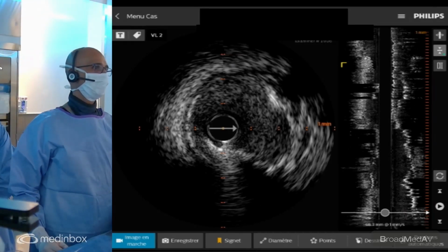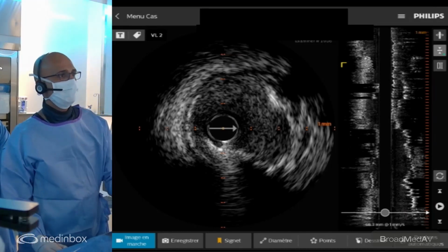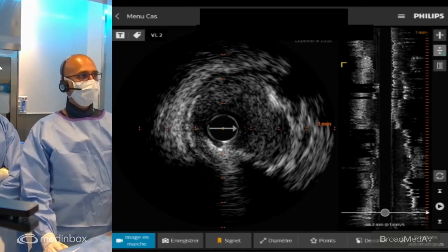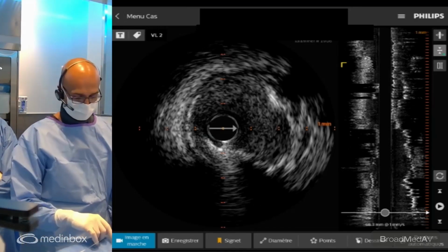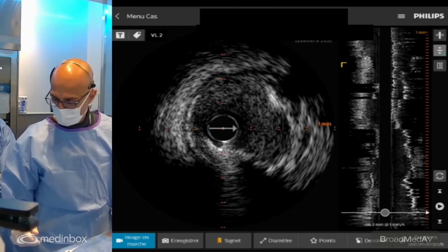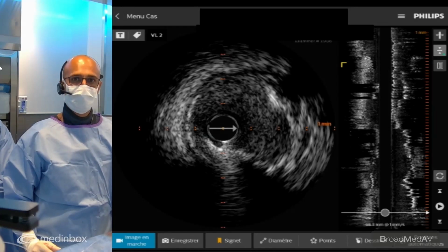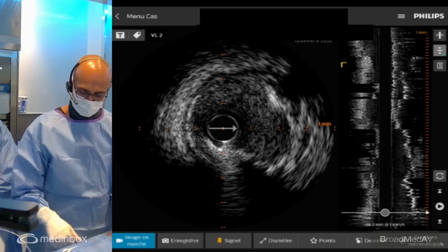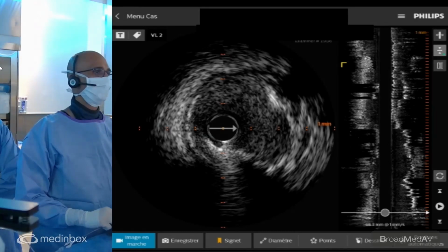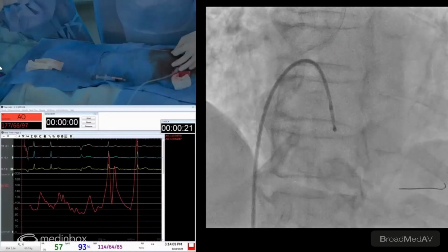Bring up. Good. 14 atmospheres. And the advantage of the Synergy Megatron also is that it has a much higher radial strength than other stents. So perfect when you're dealing with such plaque burden and calcium. Very nice for ostial lesions that are highly fibrotic as well, because you don't want only the stent to open. You want the stent to open and stay open in the long run. So we don't want it to recoil, and the Megatron stent is a good stent for that. There's no randomized trial to show us this, but conceptually, that's an advantage.